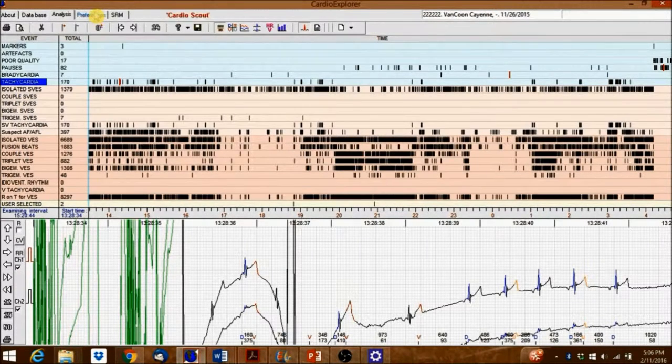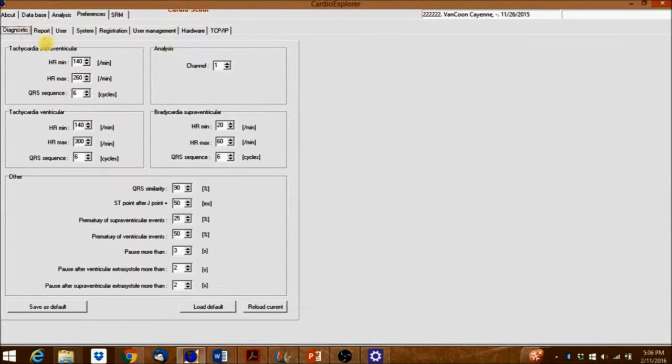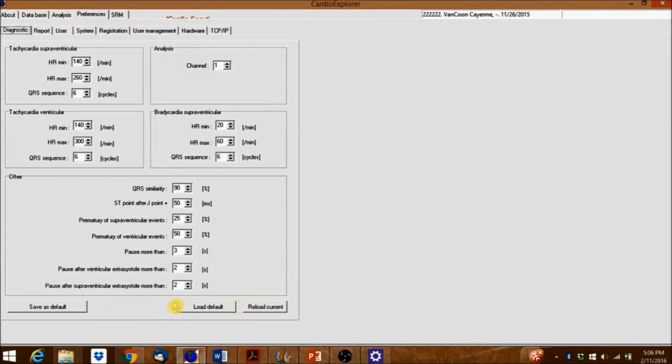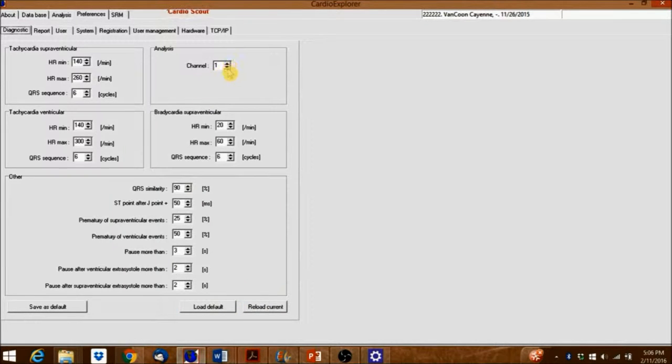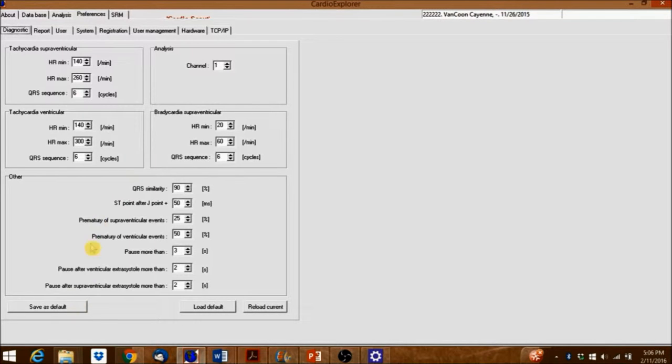Click the Preferences tab, and then click the Diagnostic tab to change the parameters if needed. Here you can also set the default channel to be used for analysis. Go back to the Analysis tab now.